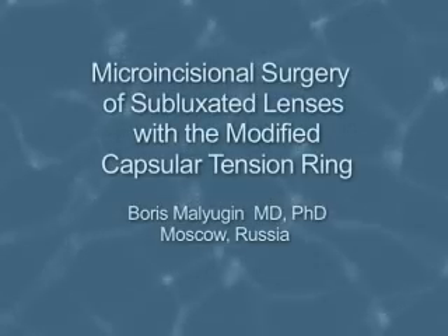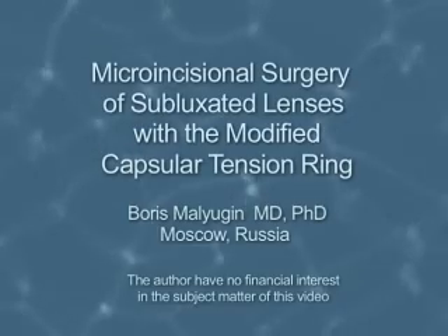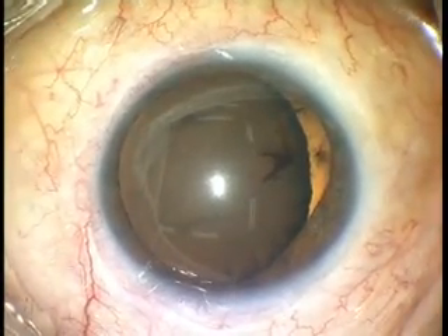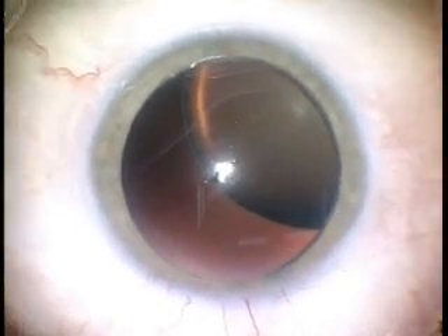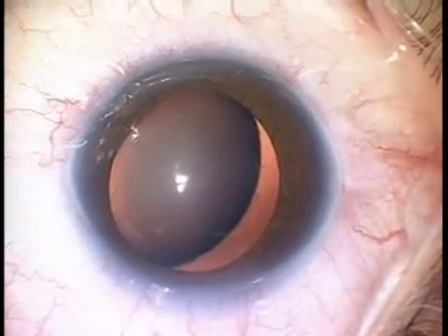Micro-incisional surgery of subluxated lenses with the modified capsular tension ring. Zonular lysis can be secondary to trauma or associated with a systemic disease such as Marfan or Weill-Marchesani syndromes, homocystinuria, and some others.